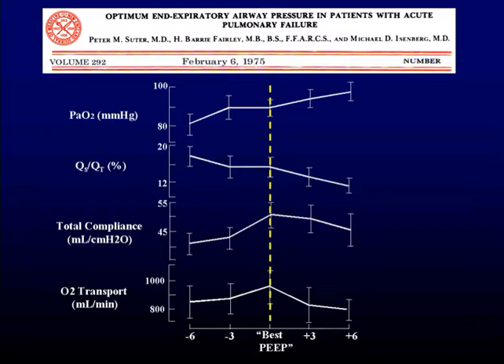But by only having an increase in pressure, that is only looking at the inflation limb of the pressure-volume relation, they missed a lot of information.